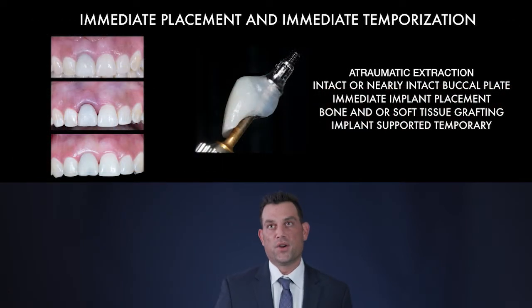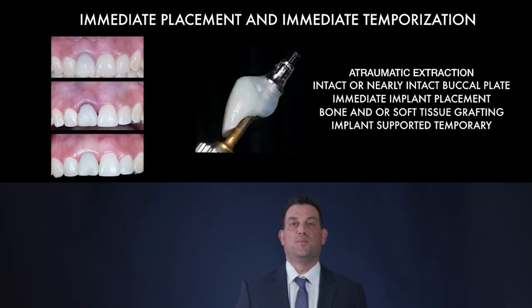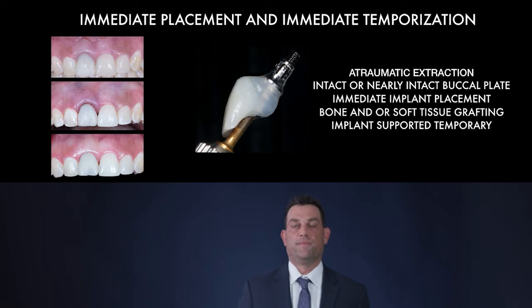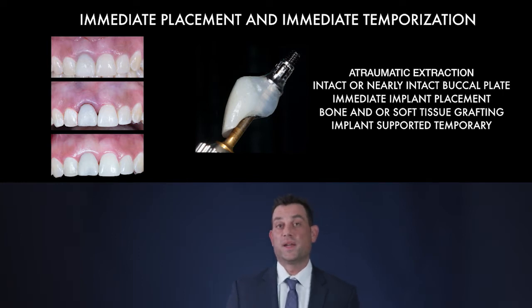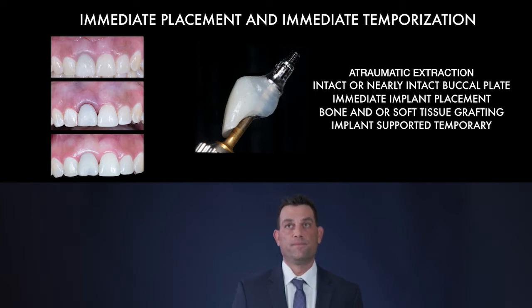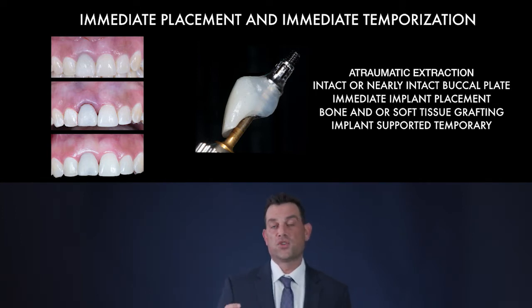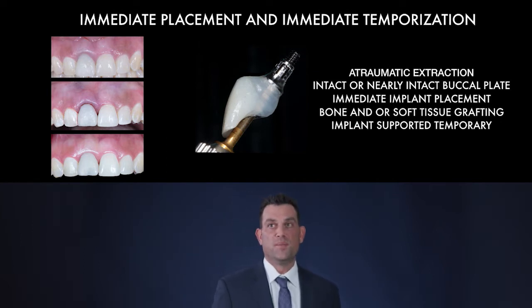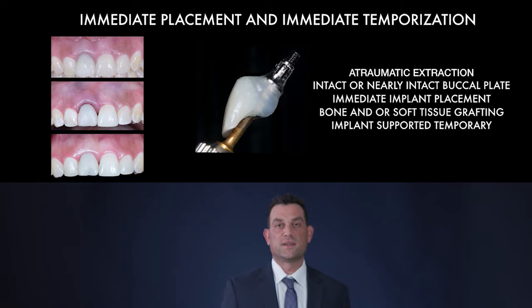In the ideal scenario, we're able to place our immediate implants and immediately temporize our implant prosthetics at the time of placement. This requires atraumatic extraction, intact or nearly intact buccal plates, immediate implant placement, bone and or soft tissue grafting, and then restoration with an implant-supported temporary prosthesis.